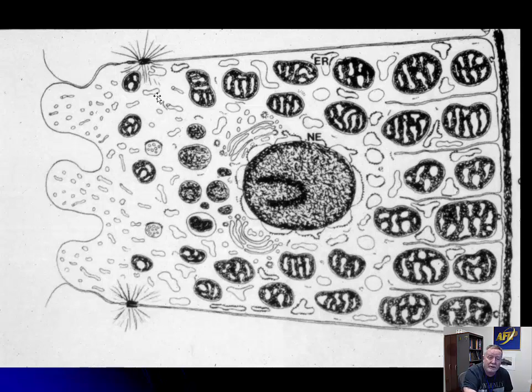Well, they're gone too. The actin filaments that form the structure have probably changed from a fibrillar back to a globular, and so when that happens, they just sort of go away because they're just linear elongations of the cell membrane. They disappear, so the cell membrane becomes somewhat undulant here.